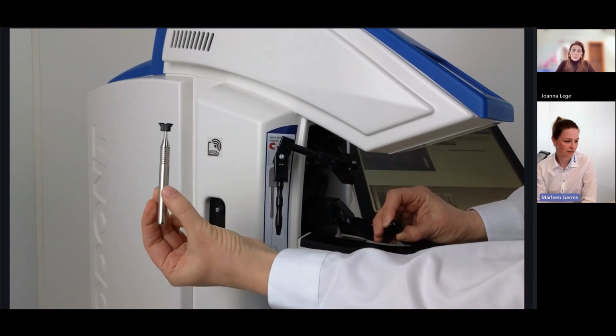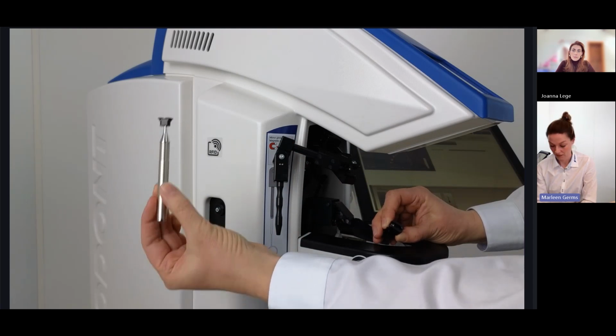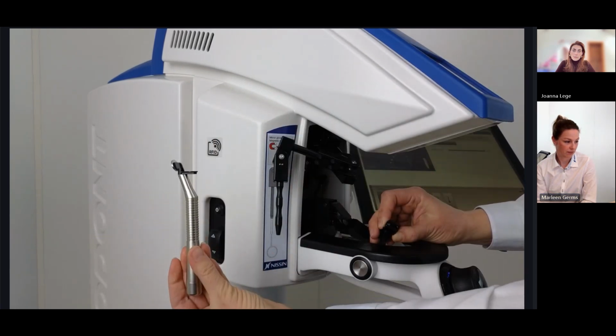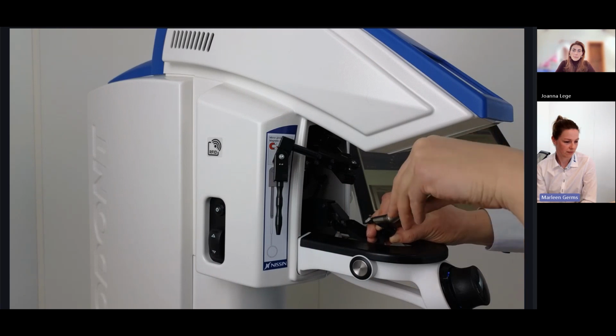Here you can see how it looks when it's not attached to the Simodont. I'm now going to grab the drill handpiece that you're all familiar with, and I'm going to slide it in the same way I detached the perio handpiece.